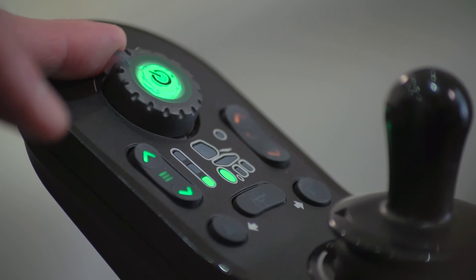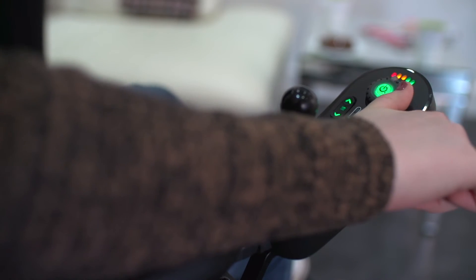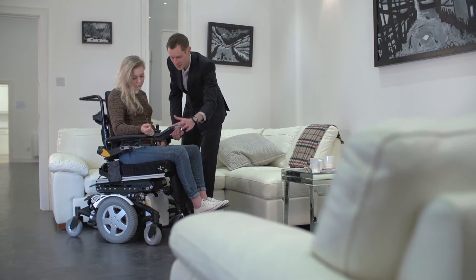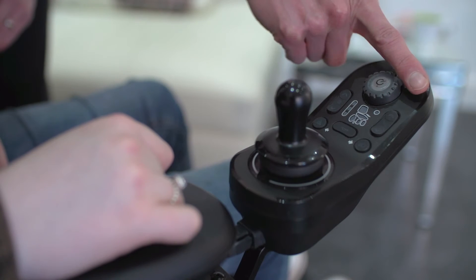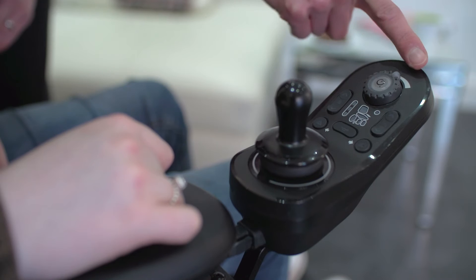The speedpot built into the on-off button can be used to adjust the maximum speed within a drive function. This mechanical speedpot is easy to change for all users, even those with limited or fine hand control. The speedpot is also clearly visible at power-up, so avoids anxiety for users who are worried about the initial power chair speed.